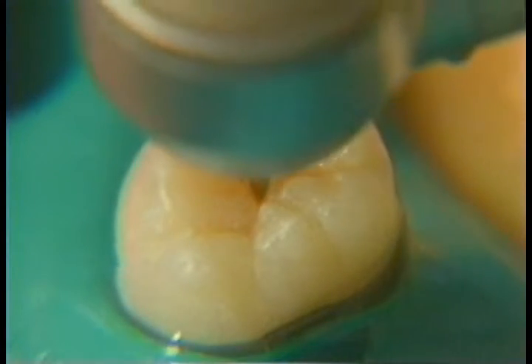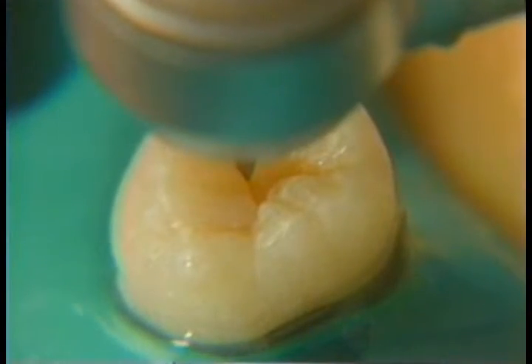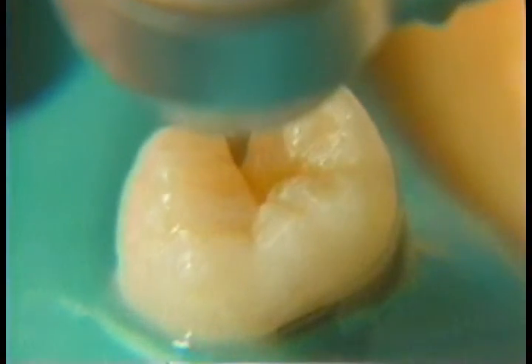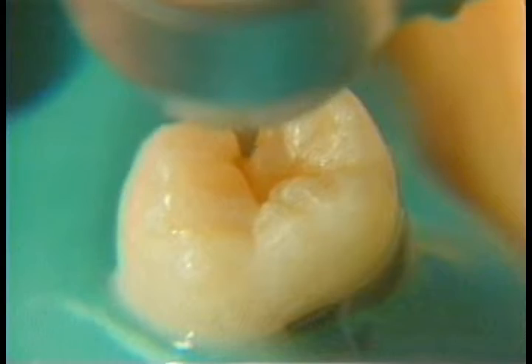It's small enough that I'm able to remove it with the fissurotomy burr. Right here the caries appears to be a little larger, so I'm widening the prep slightly with the burr.